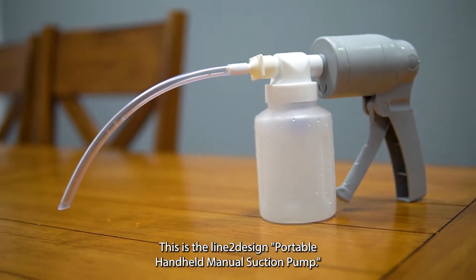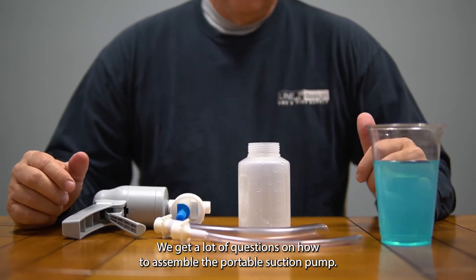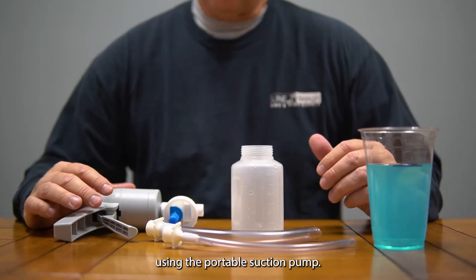This is the Line 2 Design portable handheld manual suction pump. We get a lot of questions on how to assemble the portable suction pump, as well as how much liquid can actually be extracted using it.